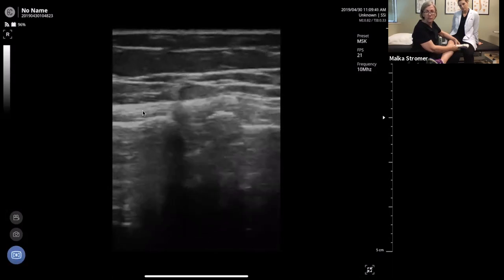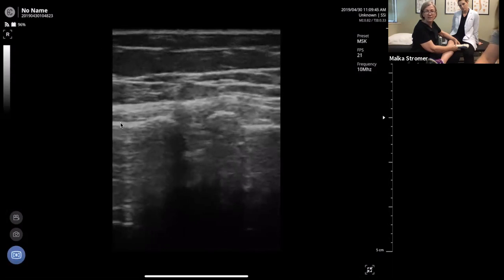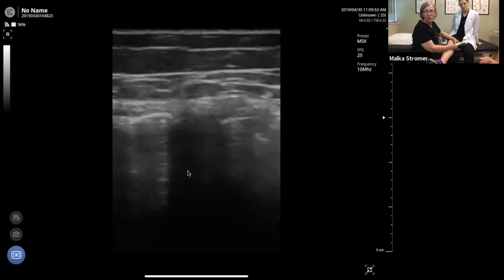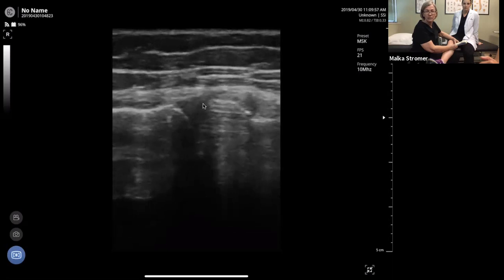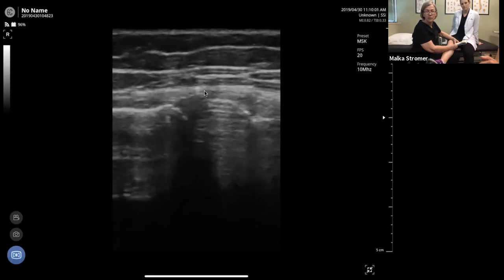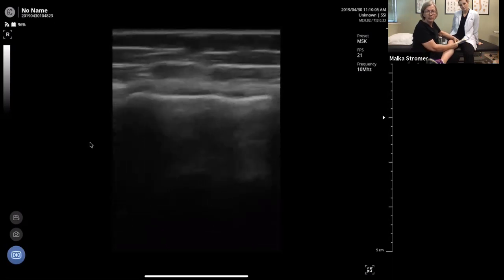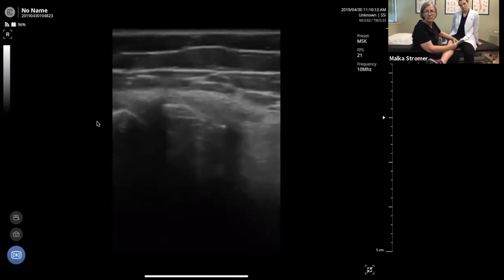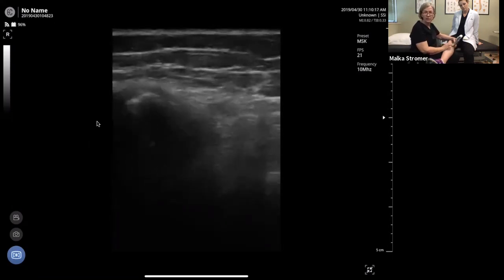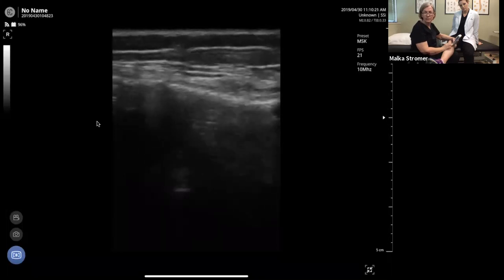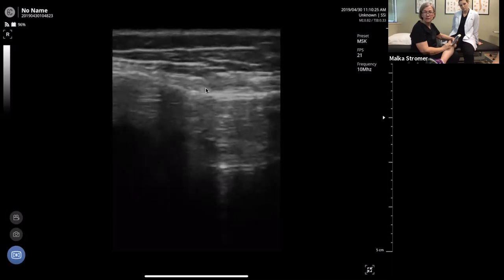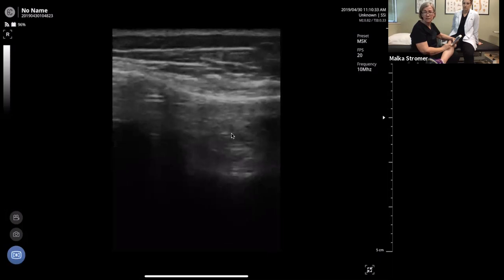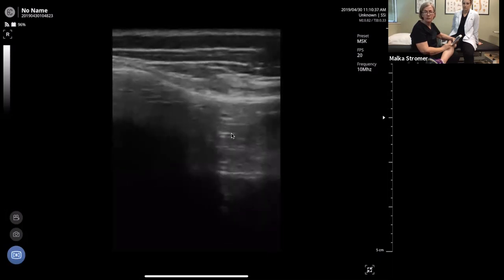You can see the nice slice of pie-shaped meniscus right in the middle. The medial collateral ligament is a small, thin line running through there. I'm coming proximal up to the attachment at the femoral condyle, then running it distal — angling a little bit anterior. You can palpate where the three tendons of the pes anserine come in, and right through here is the pes anserine bursa. A bursa is a potential space, so unless it's inflamed, you're not going to see it. This all looks beautiful — Kira obviously takes care of her knee.